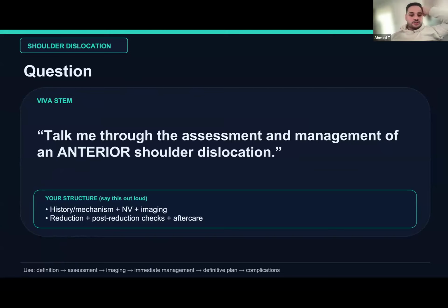All right, so now with the fun bit. This is the question mostly you're going to be asked first after being presented with the shoulder dislocation X-ray. So can someone, as we've mentioned in the first slide, try to make it systematic: clinically, radiologically, and biochemically, initial management, and then definitive management, history and everything. Would someone like to give it a try?